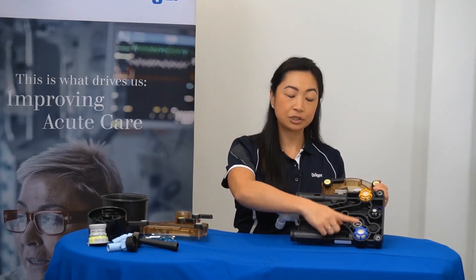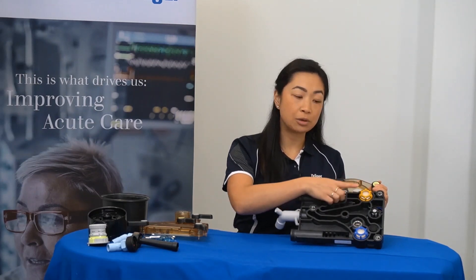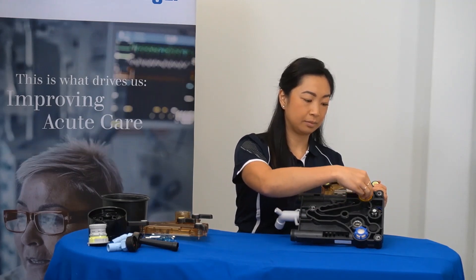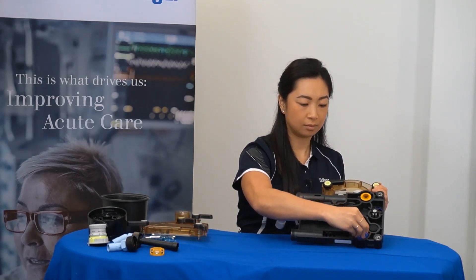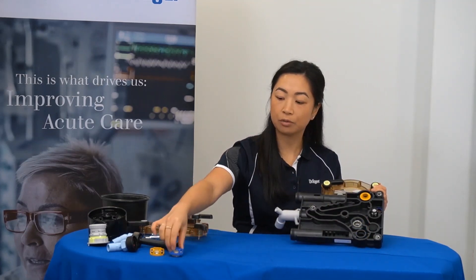Now, the inspiratory and expiratory valves can be removed. Ensure that you avoid holding onto the plastic disc. A forward and backwards rocking motion will help you remove the valves.